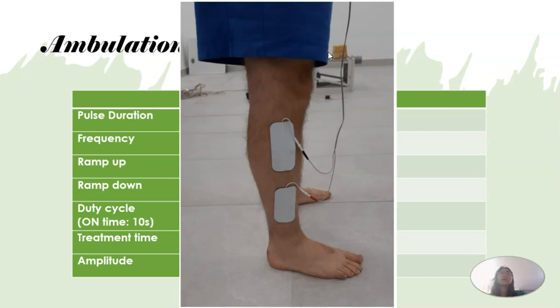So how do we make sure na yung tamang area ang merong motor point? Always palpate for the muscle and find the muscle belly. Yung gitna ng muscle belly, yun yung applyan niyo ng electrode.